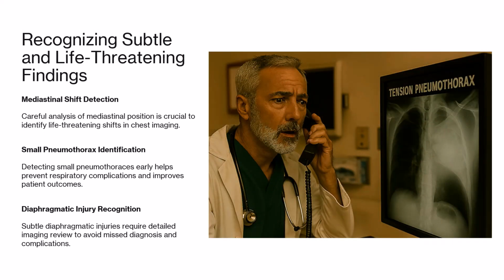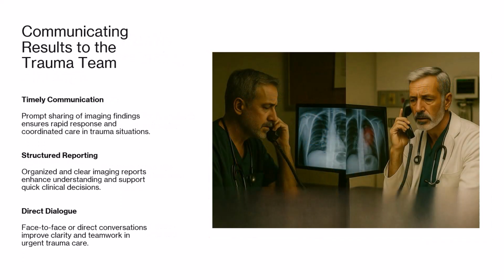Subtle signs such as a mediastinal shift, small pneumothorax, or a diaphragmatic injury require careful scrutiny to prevent misdiagnosis that could worsen the patient's outcomes. Timely and clear communication of imaging findings to the trauma team facilitates coordinated care. Structured reporting and direct dialogue improve decision-making in urgent settings.